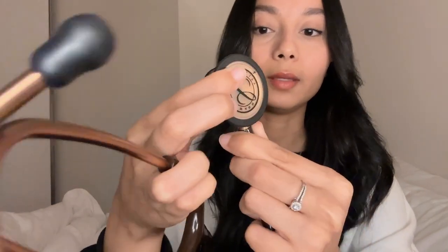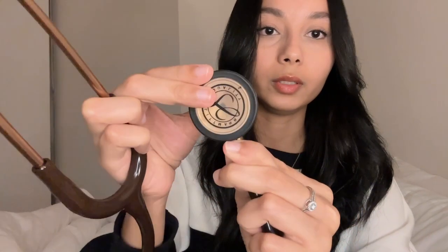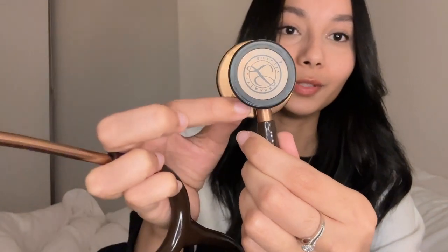This is obviously the main side that will be used, and then this side is for pediatrics and smaller animals. You can turn it. I just love this color and this finishing — it's definitely my aesthetic. These stethoscopes come in different colors: green, purple, blue, pink, different shades of blue, black, brown, and gray.